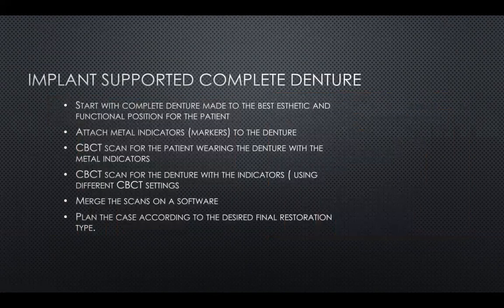So how does the process look for an implant supported complete denture? How do we do that? Again, we always start with a complete denture made to the best aesthetic and functional position for the patient and for you. So both of you have to be happy with the aesthetics and with the function of the denture.